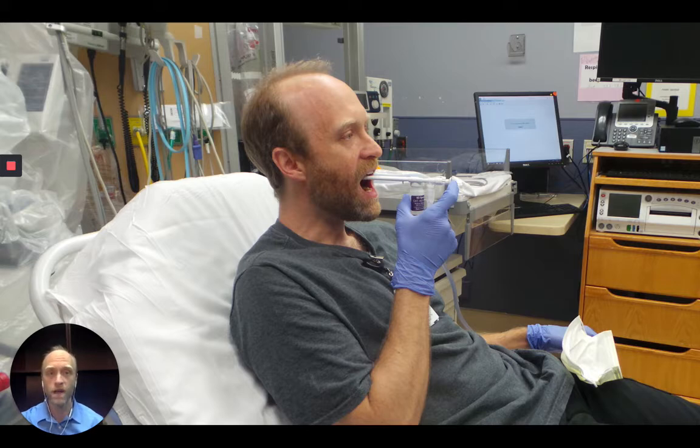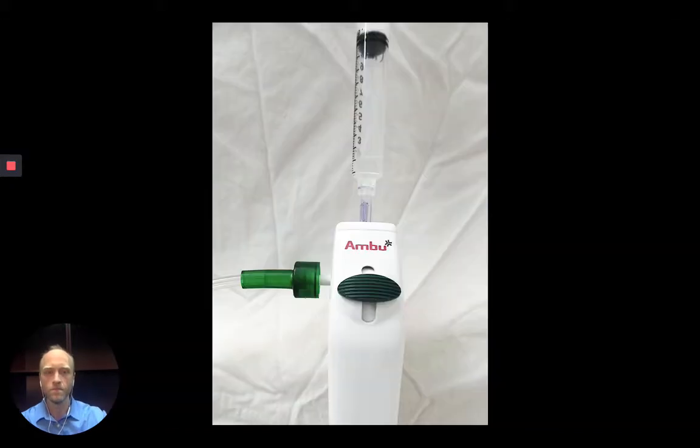Therefore, in your average patient, you still have quite a bit of room for additional lidocaine if needed for patient tolerance and still stay below 8 milligrams per kilogram. Many like to spray additional lidocaine through the working channel of the scope during the procedure. Keep in mind that it may not be necessary if you adequately anesthetize the entire airway prior to inserting your scope. It takes about 1 minute for your additional lidocaine to work, and you may cause side effects such as cough or even laryngospasm with the deliverance of lidocaine through the scope.